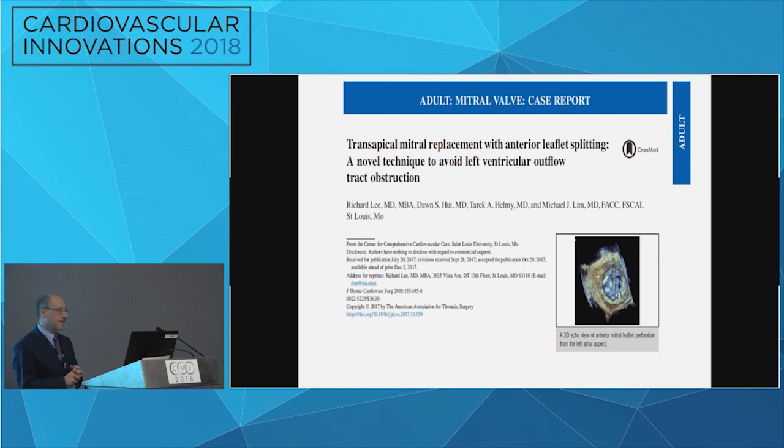That's a really great presentation. How do you gauge where to cross, or the angle where you actually cross the mitral leaflet? So this is, again, not easy. It's TEE guided, and in the first case, we get through the apex, and the surgeon starts to advance the needle under fluoro, and we end up in the septum. So he pulls it back and redirects it, and he ends up in the atrium. And it takes a couple of trials until you actually get into the anterior leaflet.